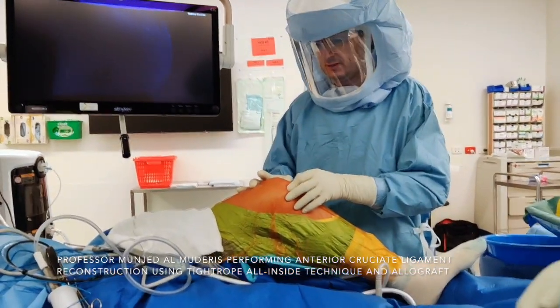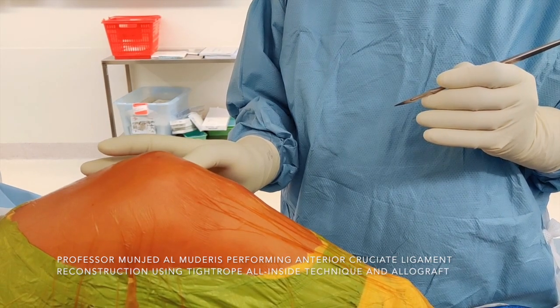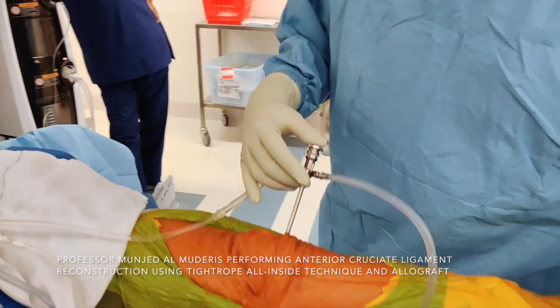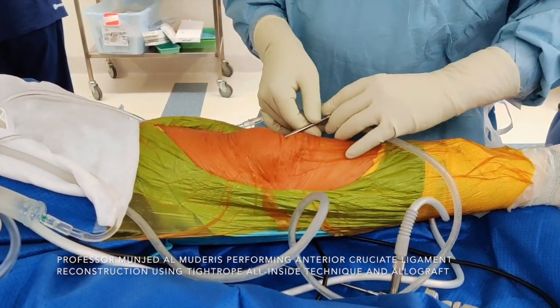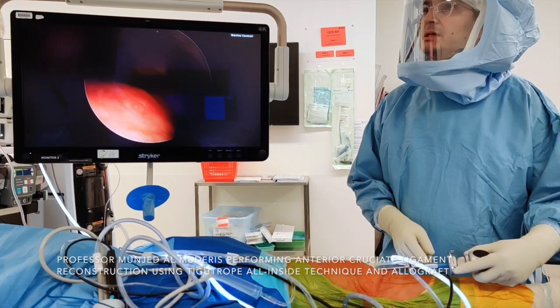We start by performing the arthroscopy. My landmarks are the inferior pole of the patella and the lateral border of the patellar tendon. I use an 11-blade to enter the joint, utilize a blunt trocar, and go into the joint. I first use suction to evacuate the joint, considering this is an acute injury. We enter the joint and I use standard arthroscopy technique.